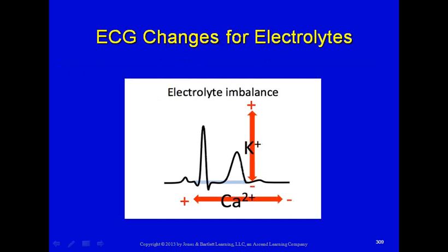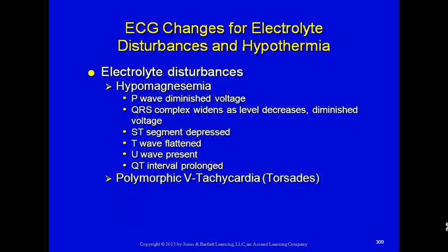Typically with calcium, as I just mentioned, your changes are going to occur with your QT interval and your ST segment being prolonged or shortened. With potassium, you're going to see high levels, peaked T waves, low levels, flattened T waves.